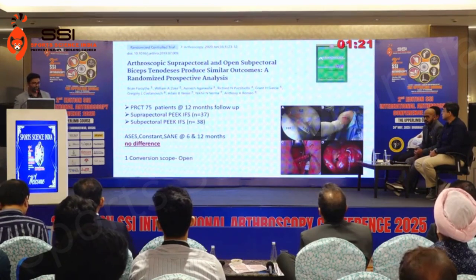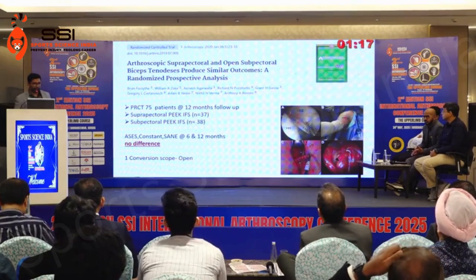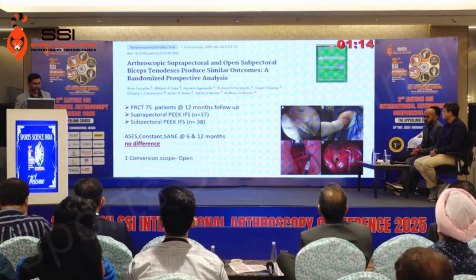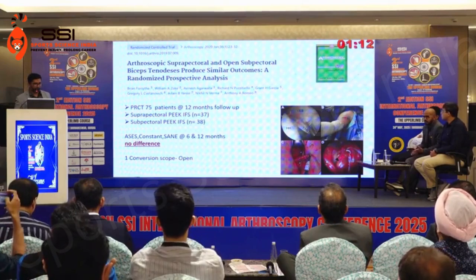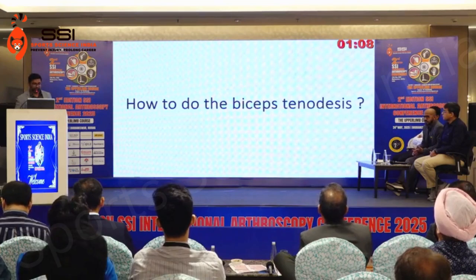Now clinically, there is only one study that I could find, a proper RCT, assessing the suprapectoral and subpectoral tenodesis, which showed no difference. Now next comes the question: how to do the biceps tenodesis?